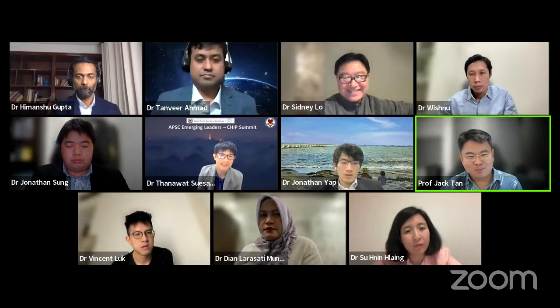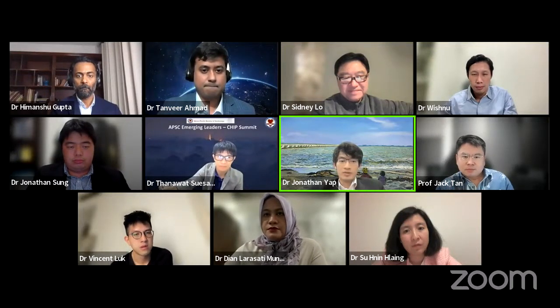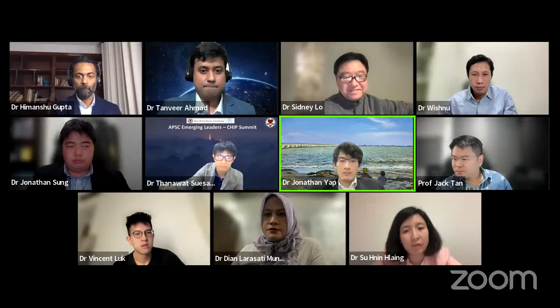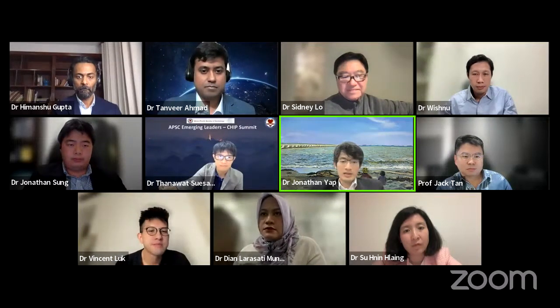Thanks, John. Those are really very useful tips and tricks that have been covered by the panel. I think one important point is to always look at the hemodynamics. If your blood pressure is dropping, you may want to take a step back instead of persisting too aggressively. And one other important pointer, that Dr.